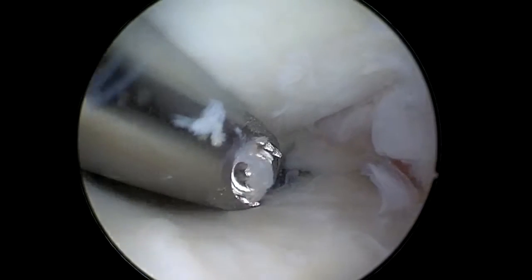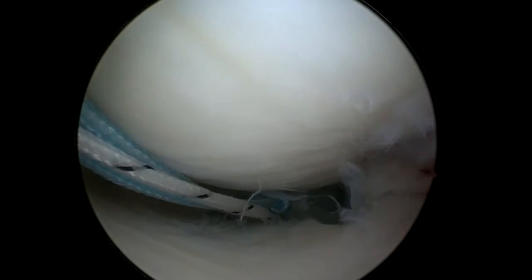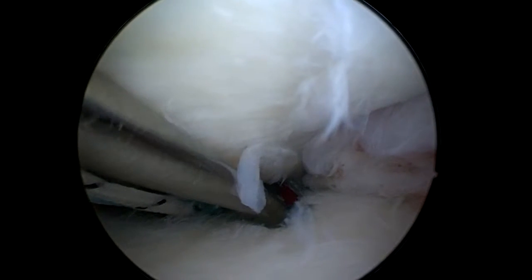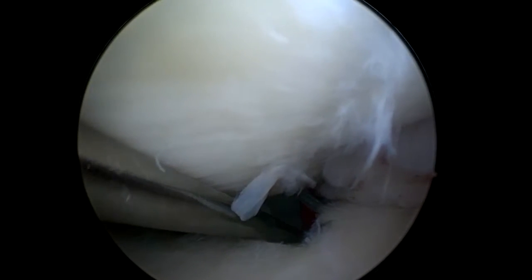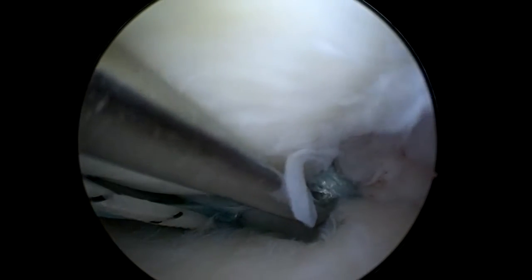Then I use my meniscus transplantation aiming guide to make a hole in the posterior side at an anatomical position. I debride it a little bit, then a suture loop is brought through the tunnel in the tibia and it is taken outside the joint, as the other two sutures are also.